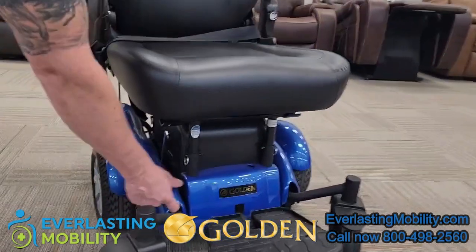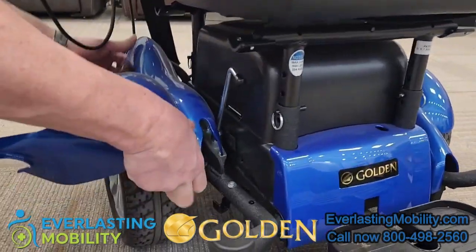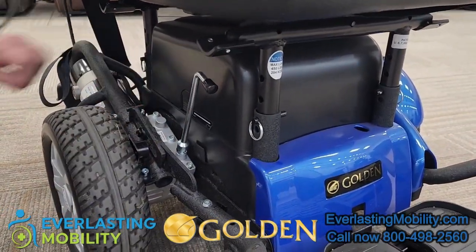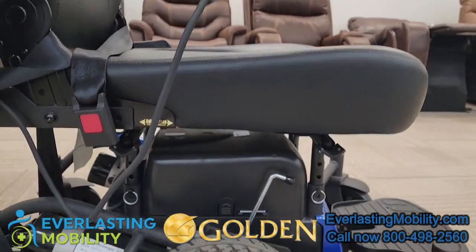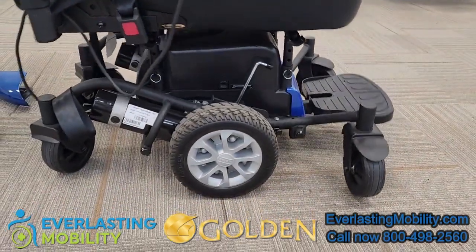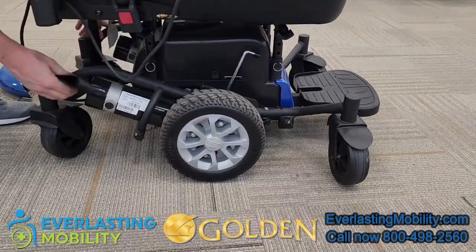This chair is a true center wheel drive chair in that it turns within its own footprint. It also comes with 22NF batteries and has a spring articulating chassis which allows you to go up a curb and then also independently back over curbs. So even at an angle, it'll adjust independently and go up over the same curb.